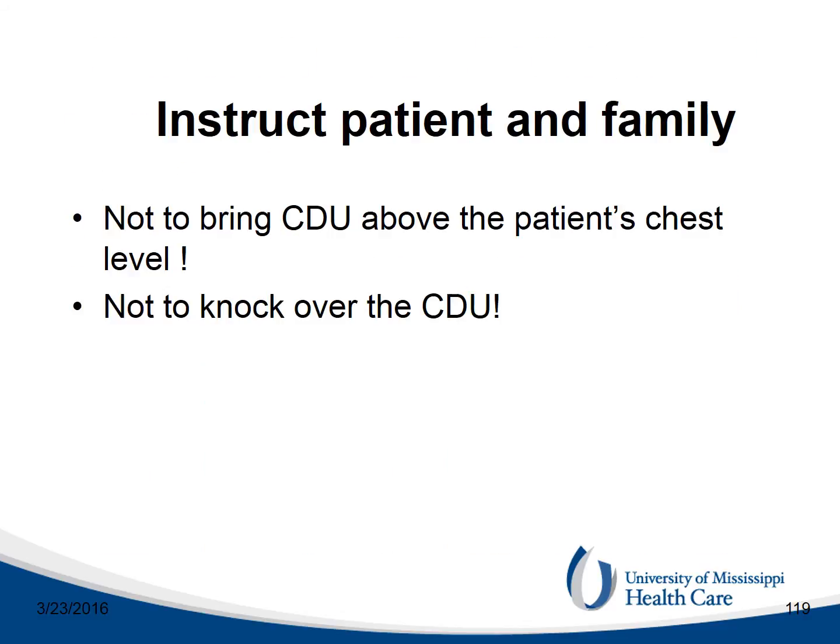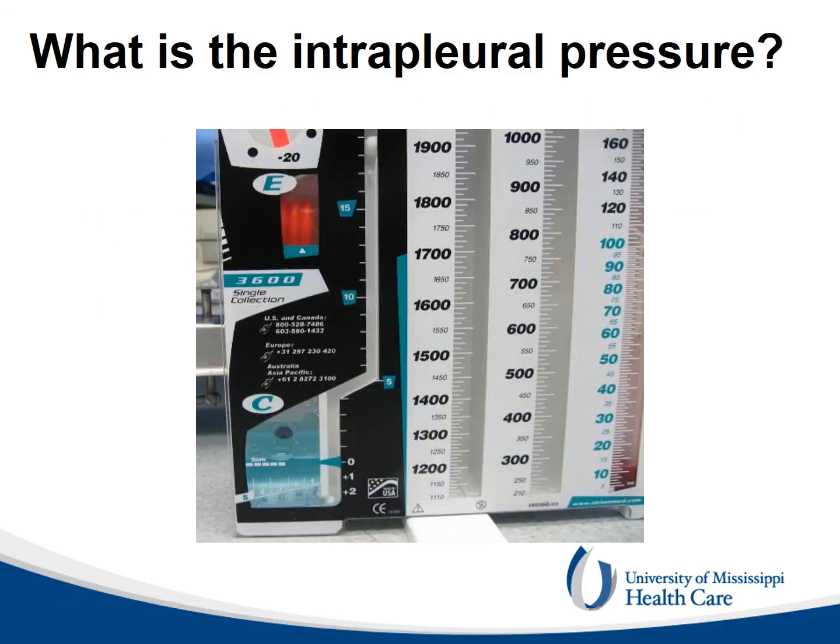The patient, the family, and all the healthcare professionals need to be instructed to not lift the CDU above the level of the patient's chest and not to tip over the CDU. In this CDU, the red bellows are expanded and therefore the system is on suction.